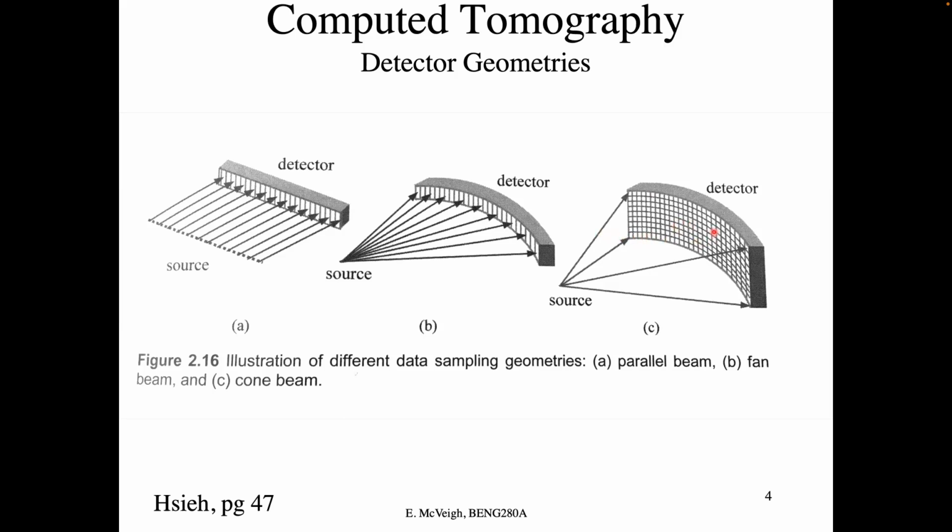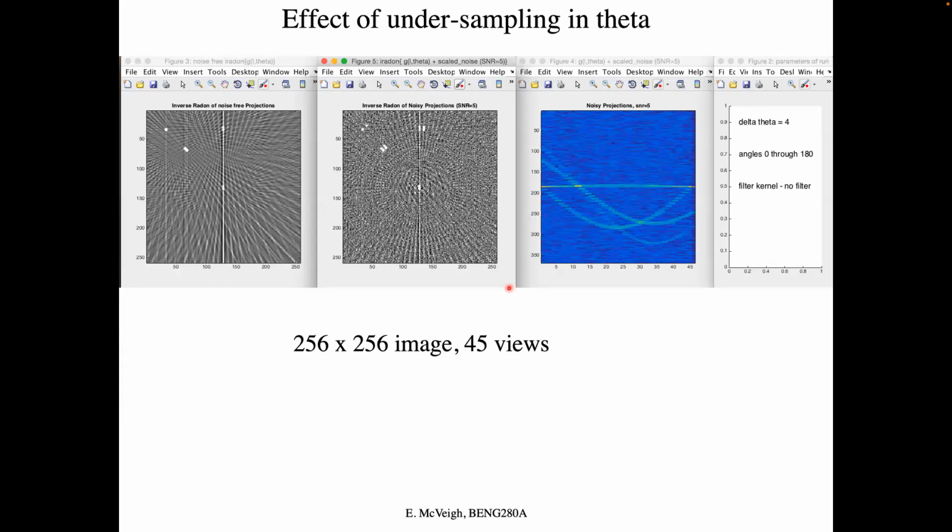It's well worth the trouble, right? Because you can get an image now in 150 milliseconds that in these bad old days would take many, many heartbeats, many, many seconds to acquire. So let's look, using that piece of code that I gave you, at what undersampling produces.